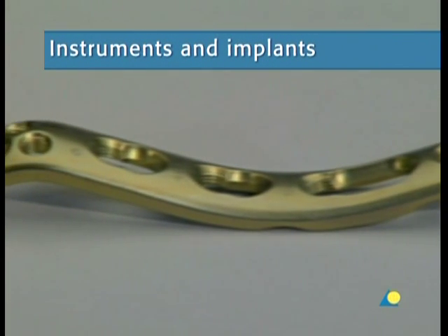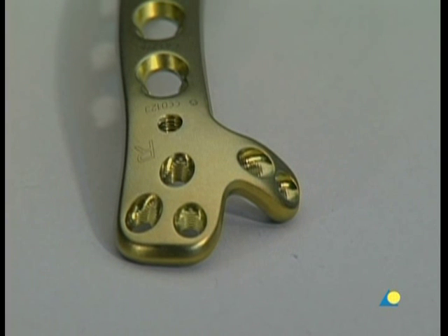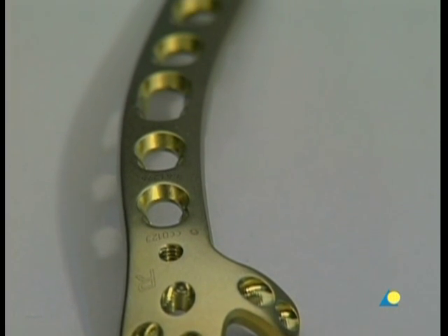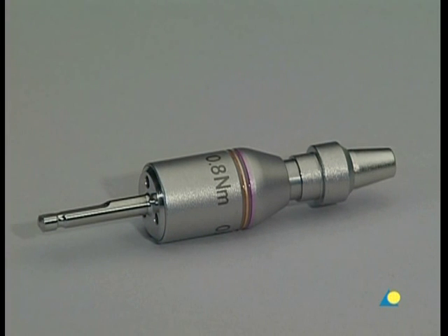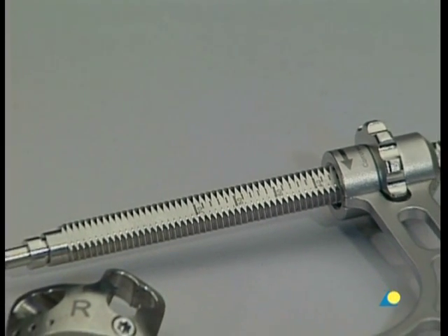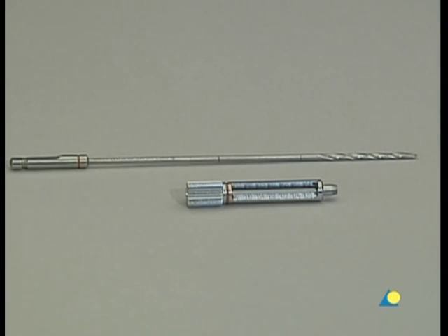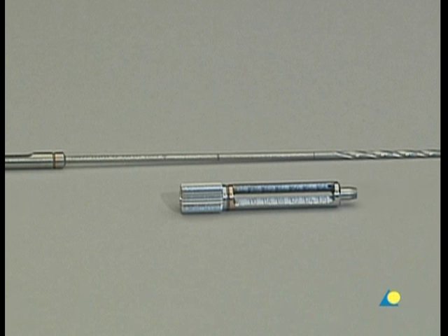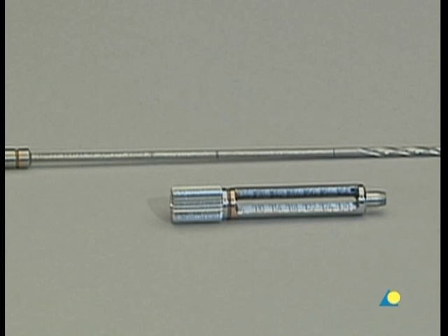The plates of the distal humerus plate system are preformed to match the anatomy of the bone. The dorsolateral plate is available either with or without a support; here, the dorsolateral plate with support is used. The following instruments are needed: the 0.8 Nm torque limiting attachment with quick coupling, the positioning and compression device with length markings for the dorsolateral plate with support, the 2.7 LCP drill sleeve with thread and scale, and the 2 mm drill bit with double markings.